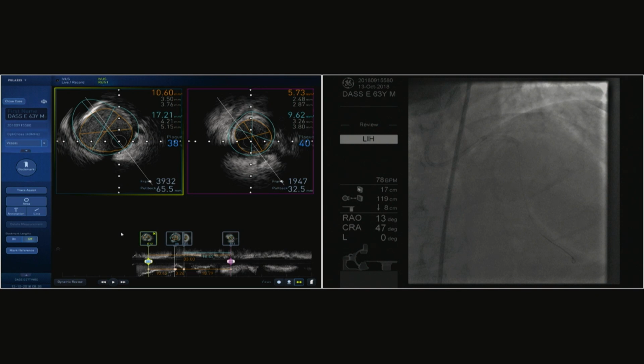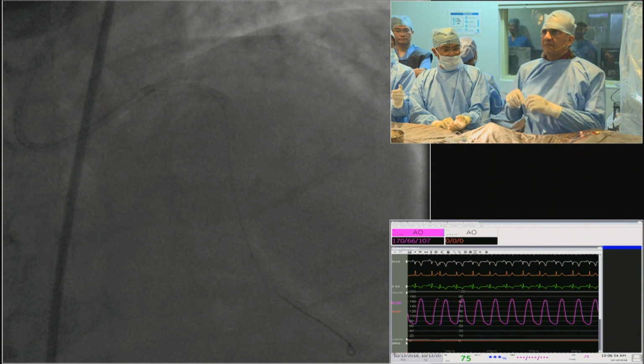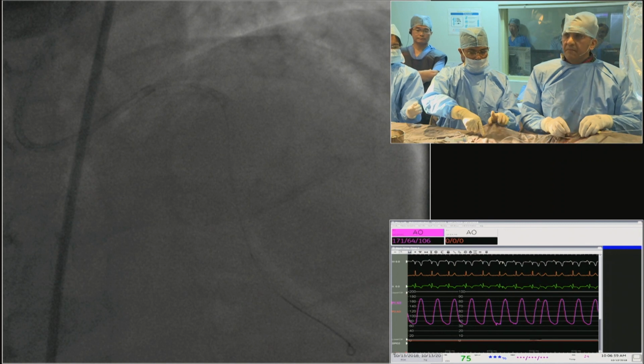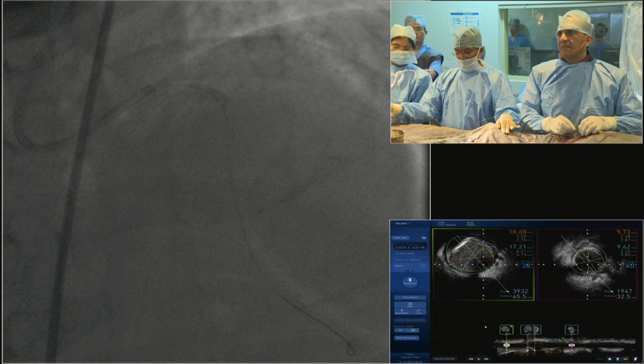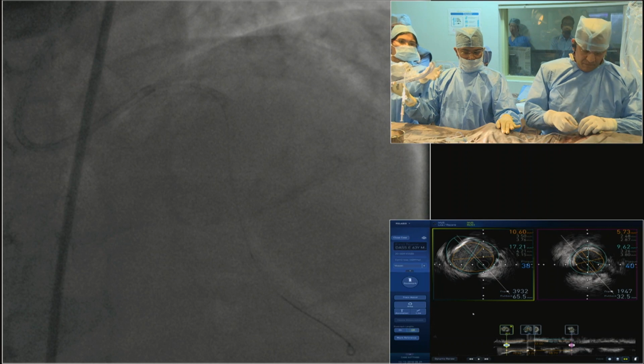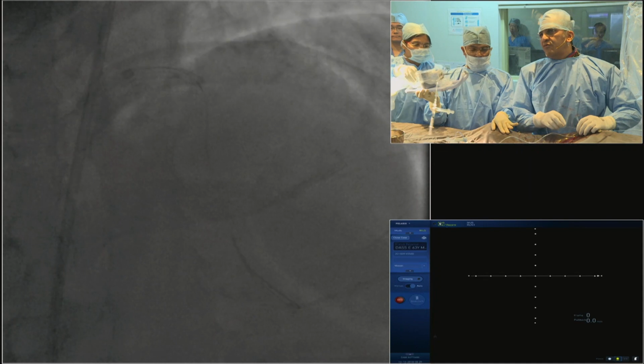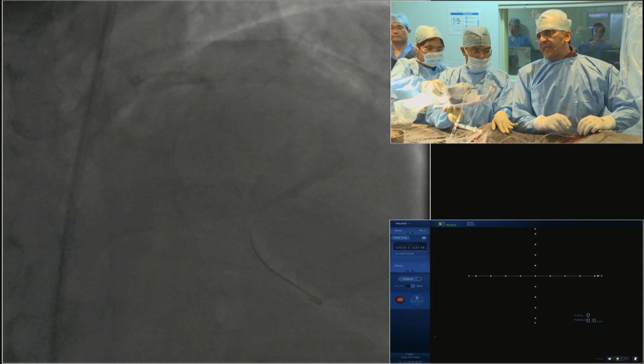Apart from the stent design, he has taken an EBU catheter, and if you want to place it in the ostial location precisely, can we put in a floating wire so that there may not be any damage to the ostial strut, longitudinal deformation? But here it's not covering the ostium. He has not covered the ostium. It was a long left main with a disease-free ostium. So there are two things that decided my landing of this stent.